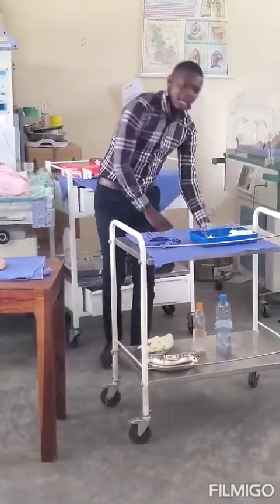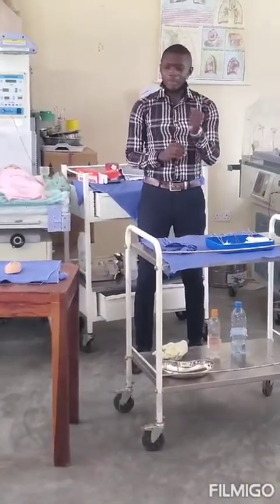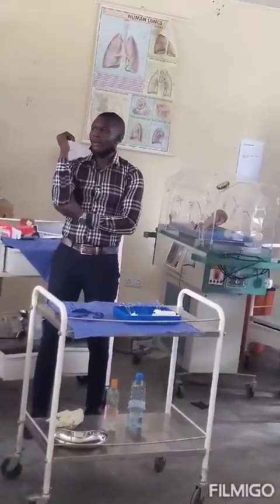So at this point, I have everything that I need to do this procedure, meaning I'm ready to scrub. So no wristwatches. If your lab coat is long, you need to fold it all the way above your elbows.